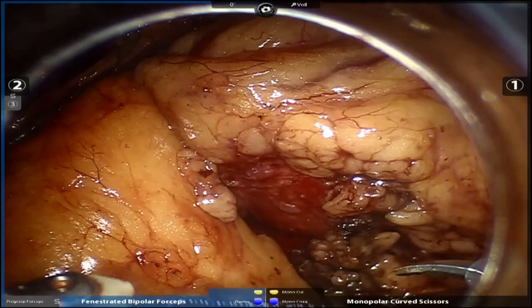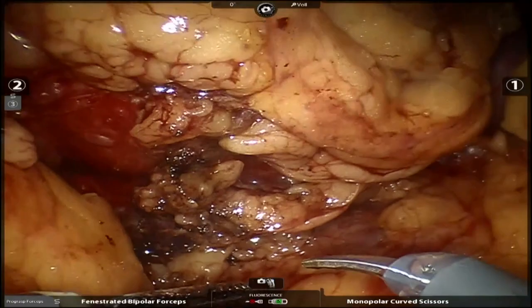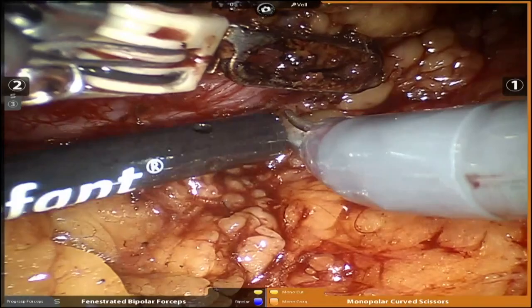In your experience, in a case like that, could it be useful to use the fluorescent Firefly capability on the da Vinci robot in order to see better, especially in cases with multiple vessels, even during the dissection of the tumor? Do you have experience with that? Yeah, I like Firefly. I use it to confirm complete ischemia. That's what I normally use it for. I know people have used it to determine differential perfusion of the tumor versus normal kidney, but in my hands, that application has not been very helpful.